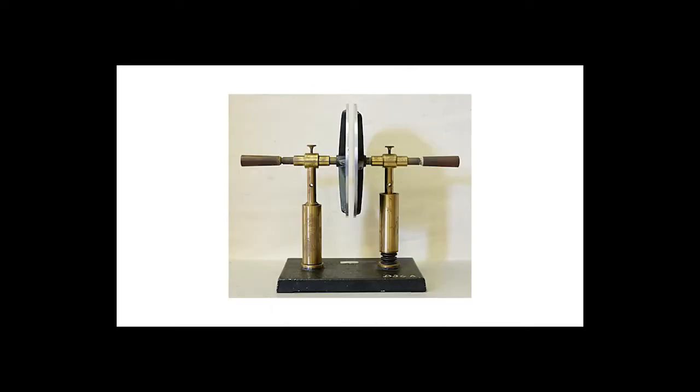In order to understand the concepts in this article regarding impedance ratio apex locators, you must first understand what a capacitor is. In this picture, this is a very simplistic capacitor, but these are two metal plates with air in between the two. The air is a non-conductive medium, and of course the plates are conductive. So in this example, the air is considered a dielectric, the non-conducting space in between two capacitor plates.